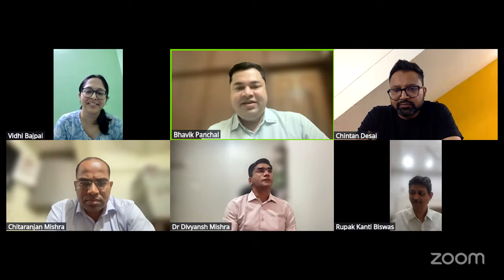Right. Wonderful video. Vidhi, you are a left-handed surgeon or the video was inverted? The video was inverted. I'm a right-handed surgeon. Okay. Like, I think there are different challenges for a left-handed surgeon. I'm not sure of that. Yeah. So great then.